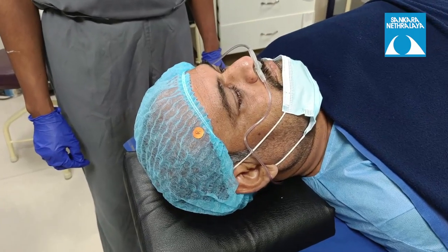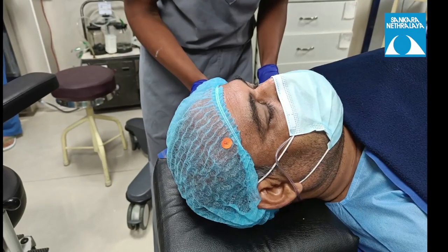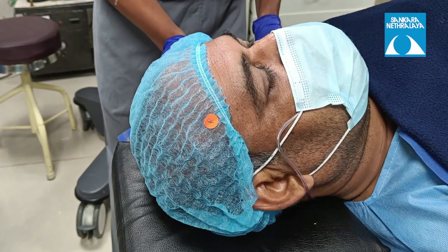The next thing is to make sure that the airway tubings are properly placed at the nostrils. During COVID times, patients are also wearing masks, so after placing the airway tubings, make sure the mask covers the nose and mouth of the patient properly.